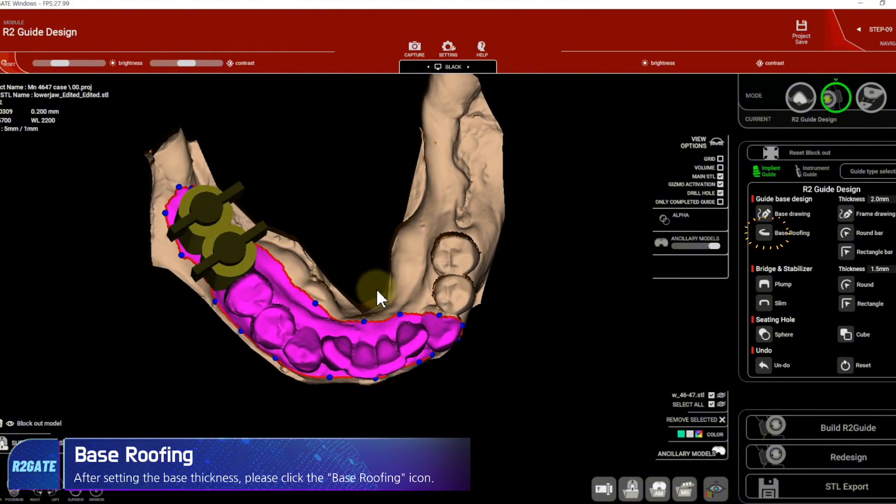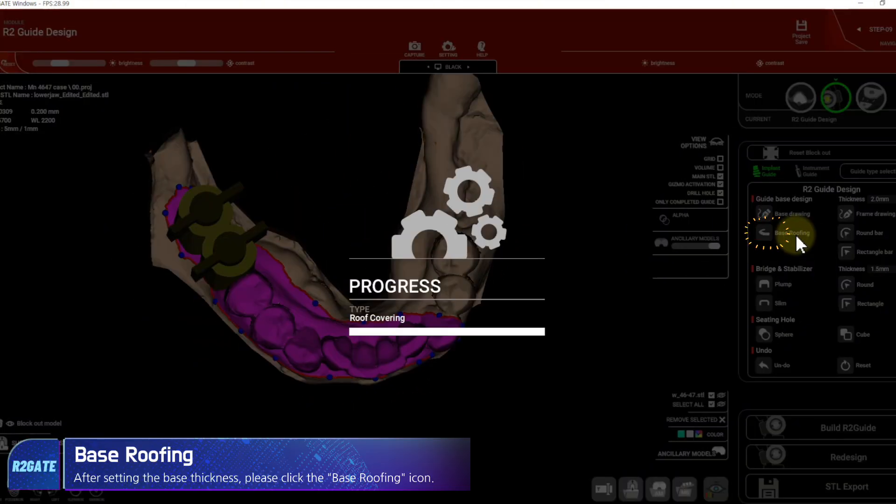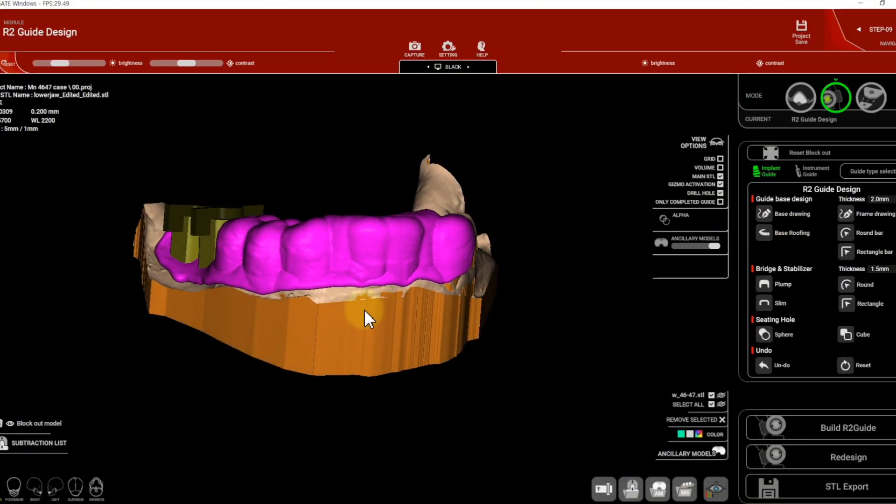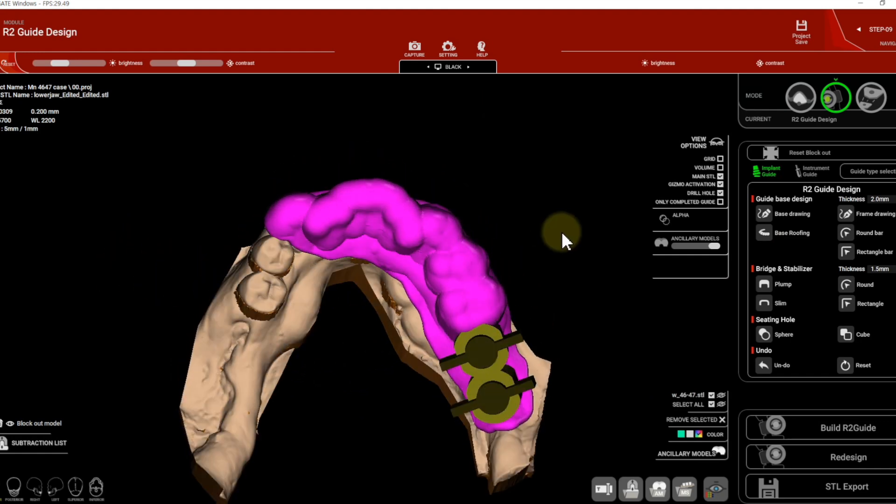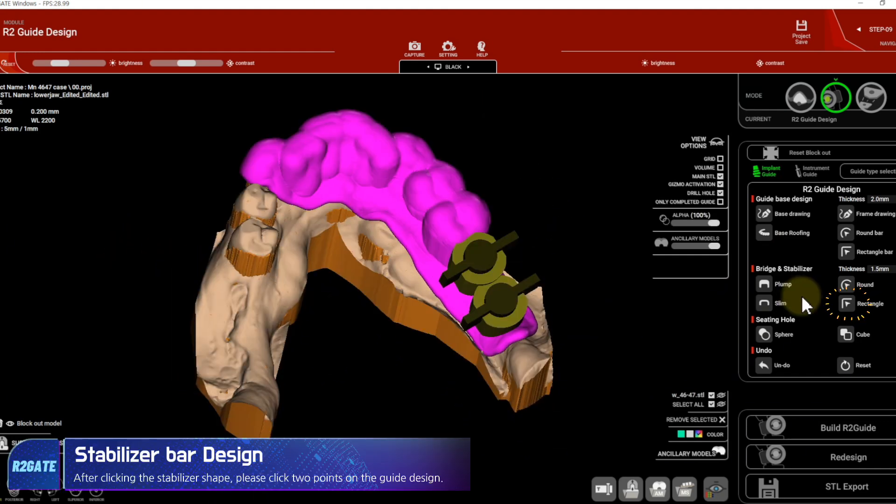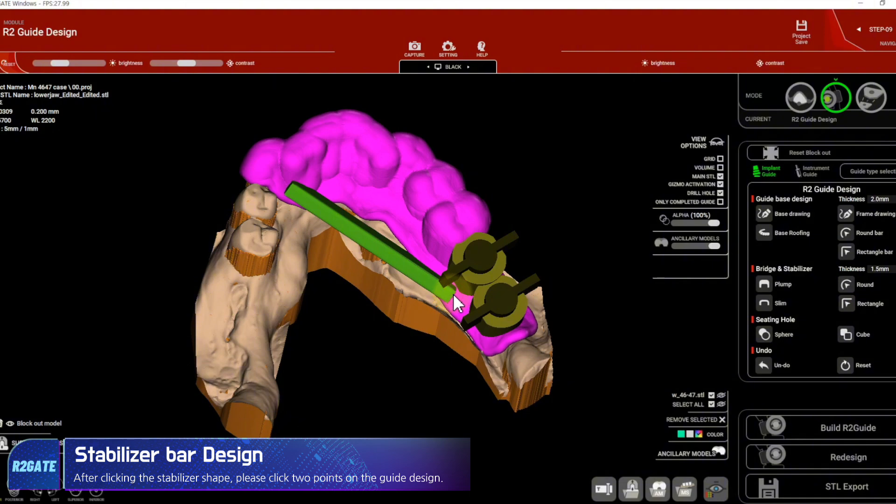After setting the base thickness, please click the base roofing icon. After clicking the stabilizer shape, please click two points on the guide design.